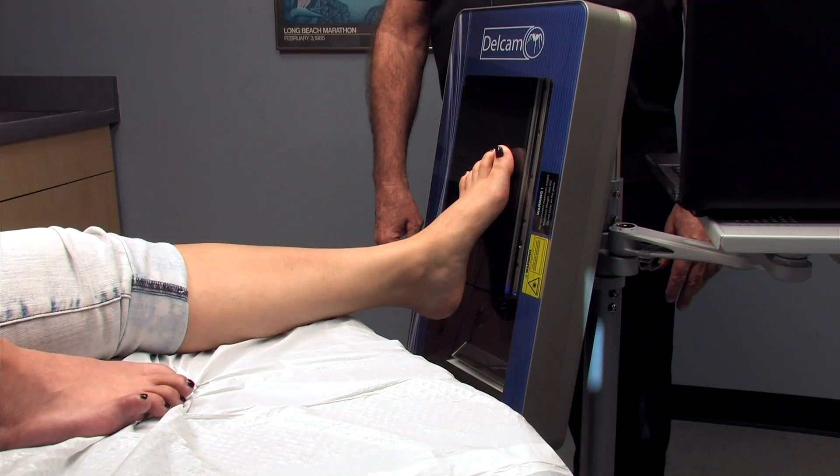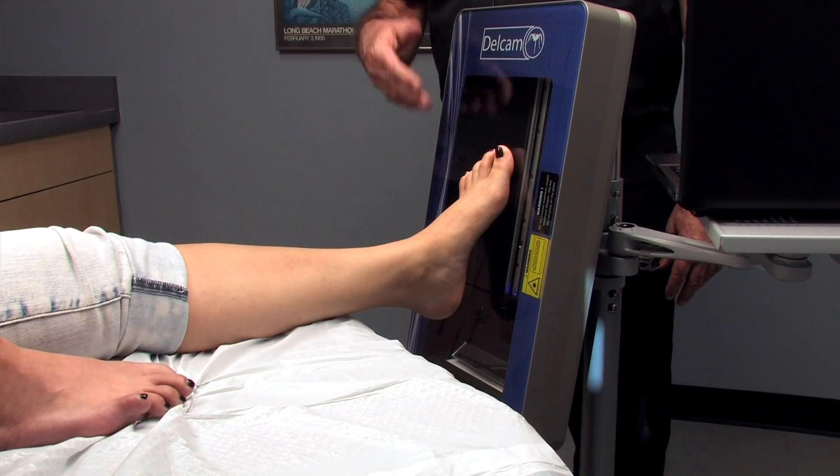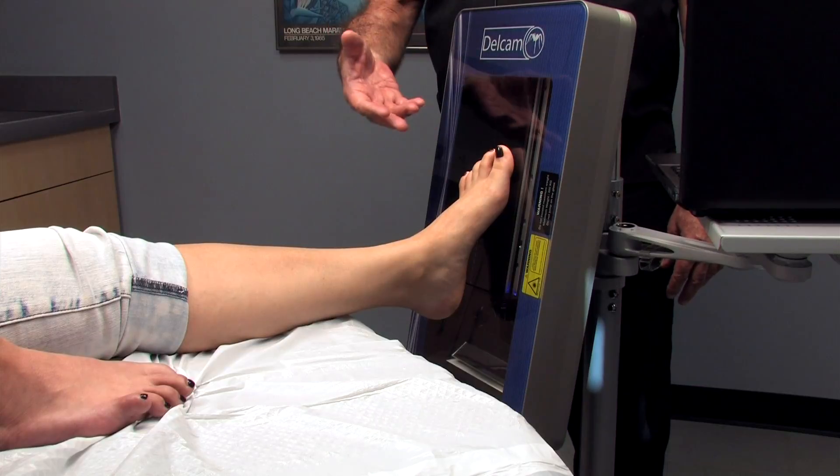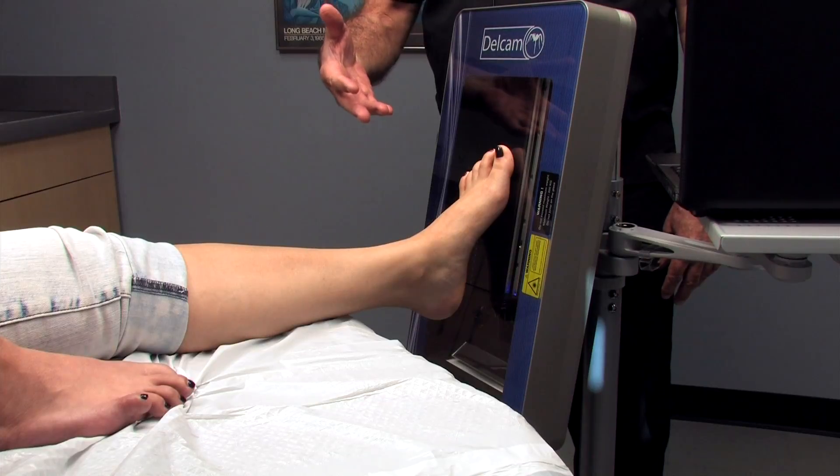We're going to demonstrate the Delcam three-dimensional scanner. This is a new technology to capture the shape of the foot following the same principles we use for neutral suspension casting.